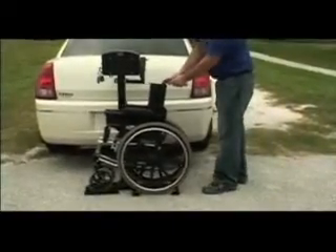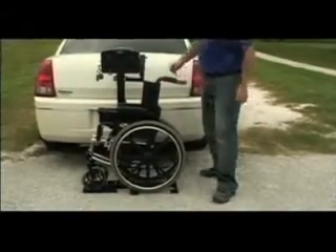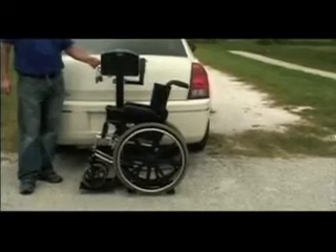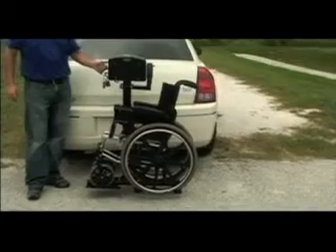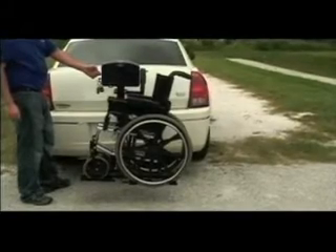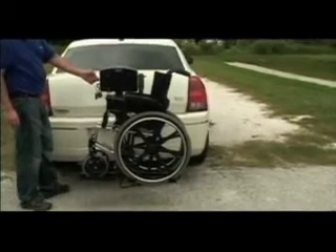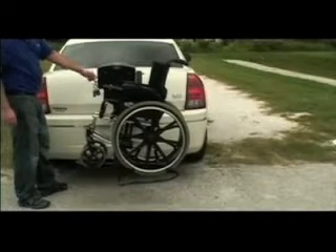Guide the wheelchair onto the platform so that the back wheels rest in the large wheel cradle. Power the lift up to its highest position. When raising the lift, it is important to continue operation until it is fully raised. In this position, you will hear a ratcheting sound from the motor box — this is a clutch. This sound is normal and should be heard. Failure to raise the lift completely can cause damage to the lift.